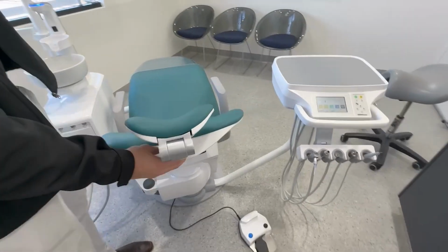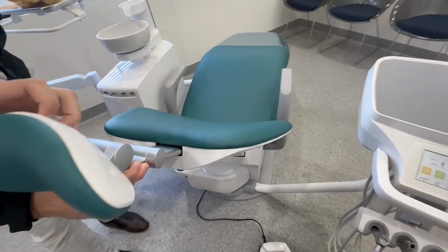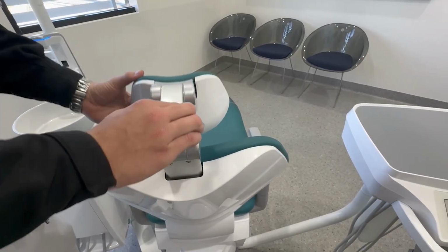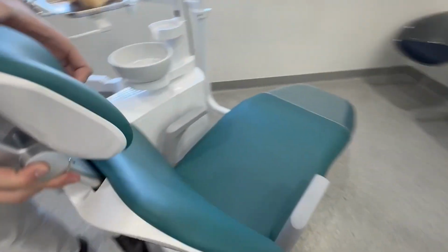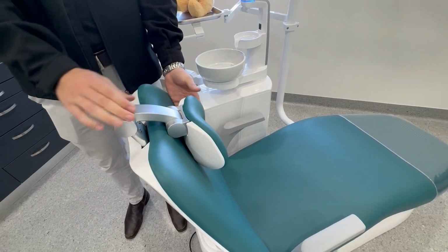Okay, so we've got a headrest here. This is a double articulating headrest. We'll just put this chair back up into the 0 position, which will be relevant for entry exit. They've got a really nice little one-touch control now on the new headrest. We've got one little push button at the side there, so we can take the headrest down on itself for children.